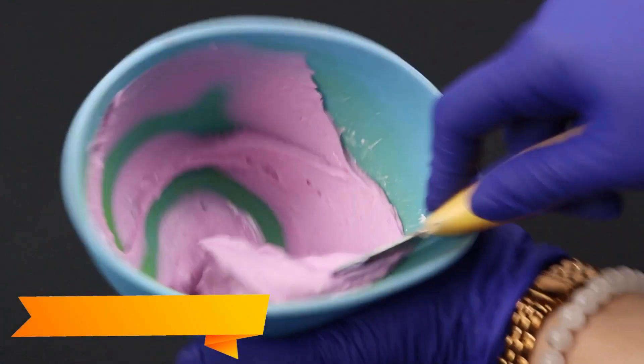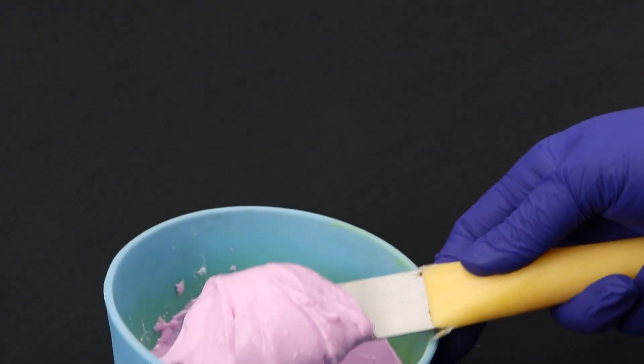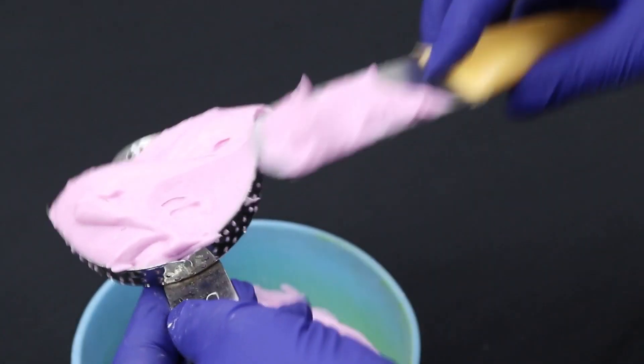As Flexiprint mixes with water, it changes color to indicate the working time. Quickly load the mixed alginate into the tray while it is still in the mixing phase, which is represented by the pink color.